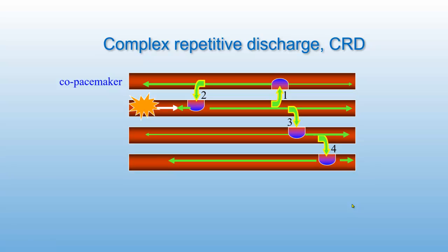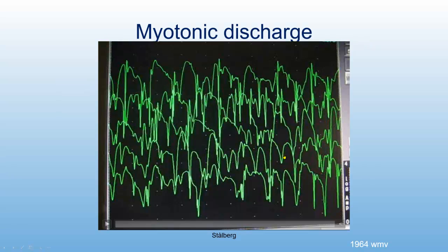So this was CRD. Another typical hyperexcitability phenomenon is what we see in myotonia. And myotonic discharges are sometimes explained as dive bombers, with increasing, decreasing amplitude and frequency. That is certainly typical, but often when we insert the needle, we just see positive waves, irregularly firing, and only when we move the needle a little, we see the typical dive bomber.